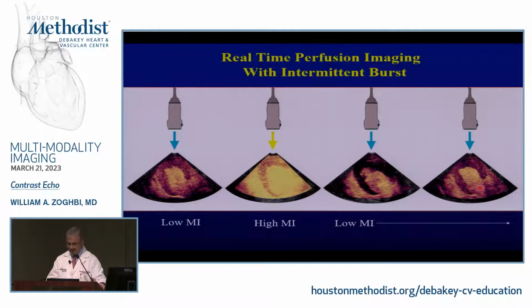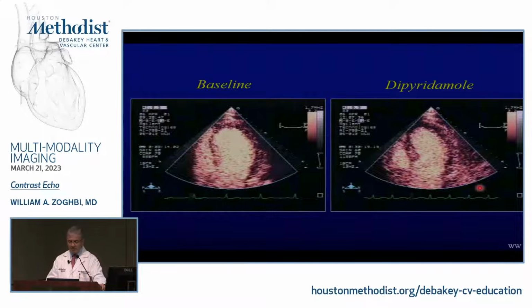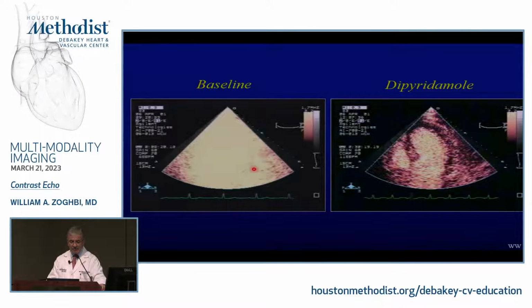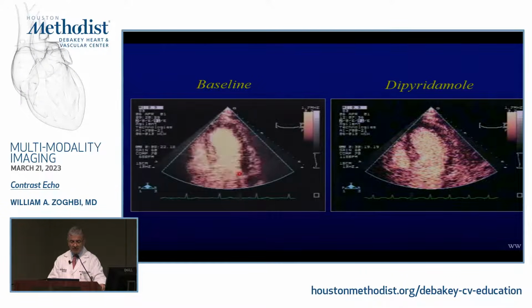So you can study perfusion. Part of the problem is some attenuation in the base. You may not see it as well. Here there's perfusion in the base, but you could see it's dark here, and there's heterogeneity. So there are technical issues.